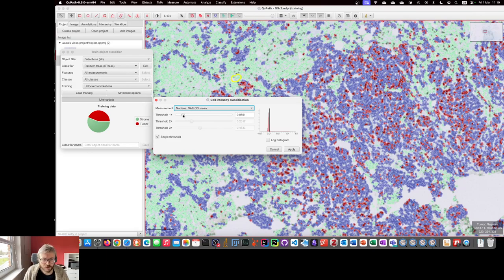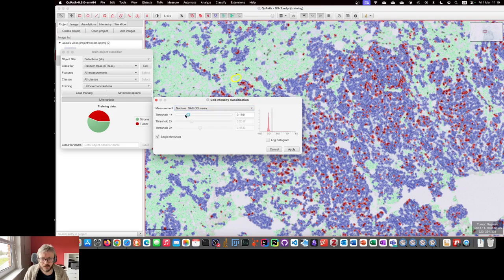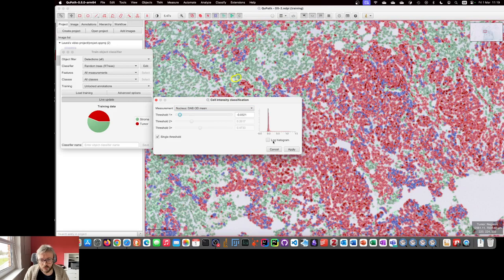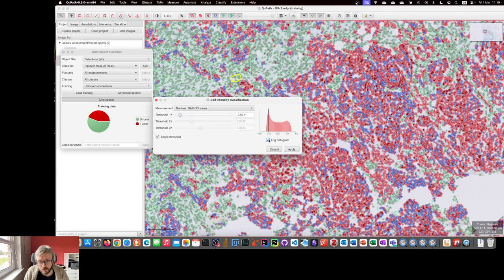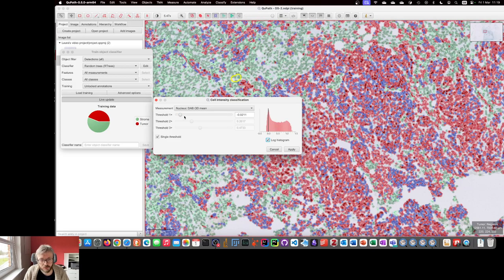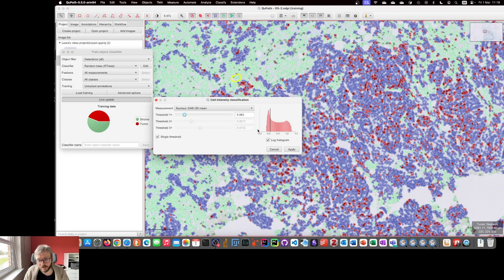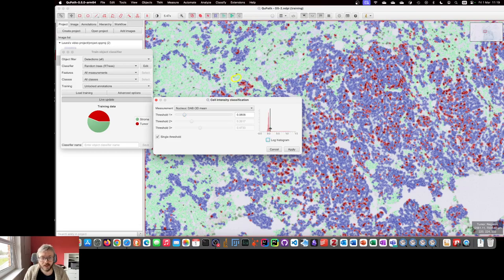A small fact to bring up here that might be useful is that although you can't resize the window, you can create a log of the histogram. So normally we see a regular histogram, and we want to set our threshold above the background pink. We can change the y-axis to use log values instead, which can let you see a little bit more what's going on.